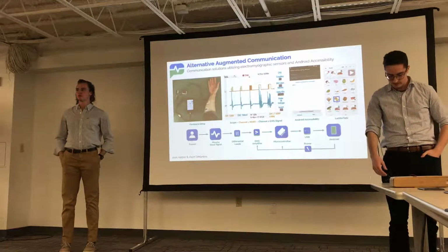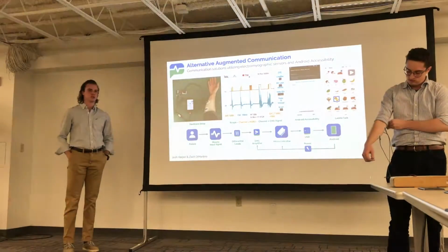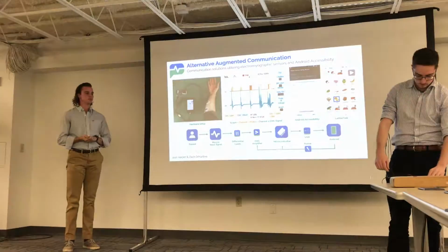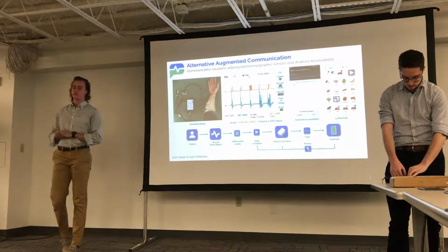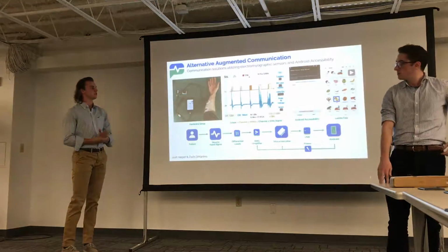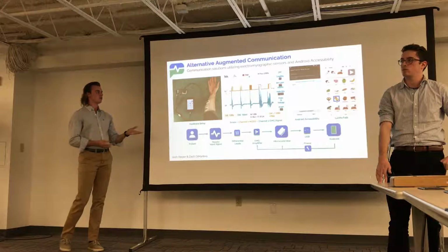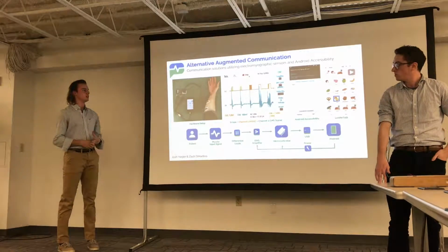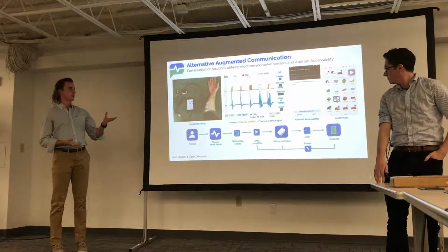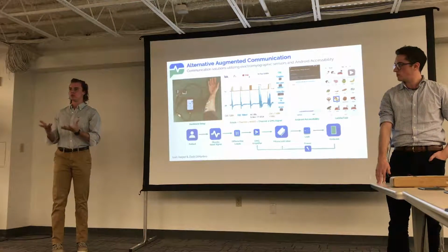So the big inspiration for this was Stephen Hawking's single input controller. You could write entire speeches and do everything with just a single facial twitch. So we are using that same idea to do a single button scrolling communication system. We have an application you can see on the far right, Let Me Talk. As mentioned in the previous presentation, a lot of these patients are illiterate and use a picture alphabet system to speak to the caretakers. Previously they have to use these large books and it's a hassle, but with this application they can select these items and then the app itself will speak for them.